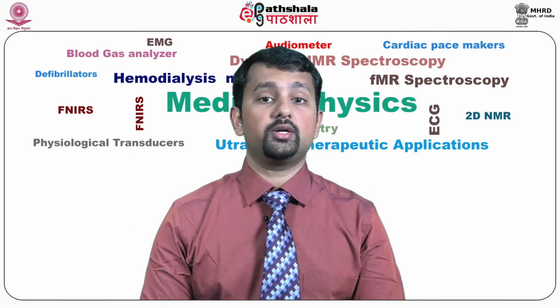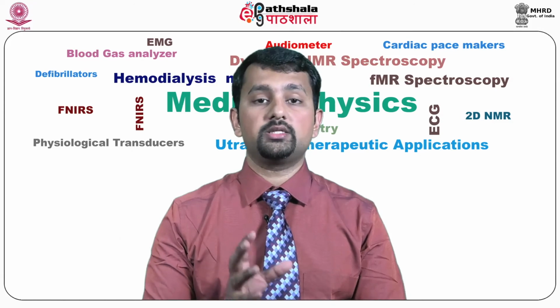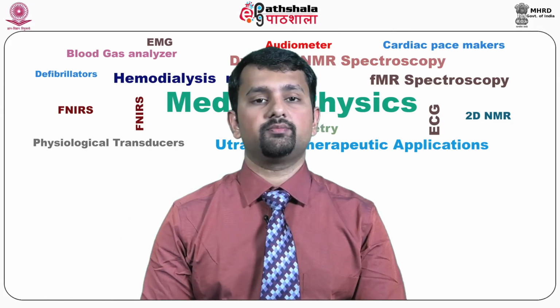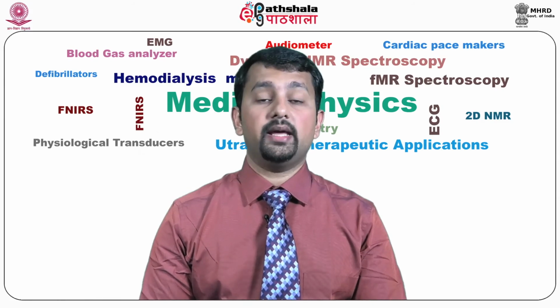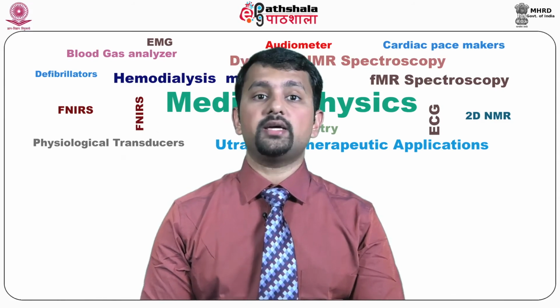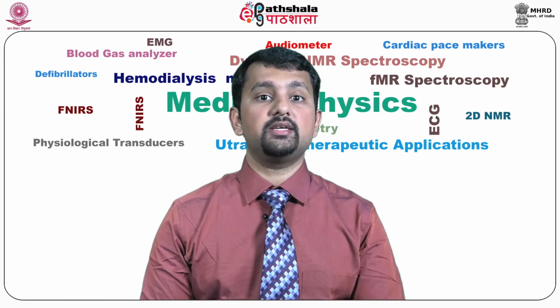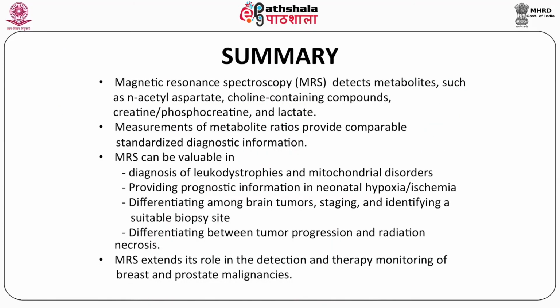This is very crucial, and a considerable amount of shimming is required before we start these studies. Artifacts can arise from dental implants, proximity to sinuses, inclusion of bone in the voxel and lipid signals arising from bone marrow. Let us summarize.